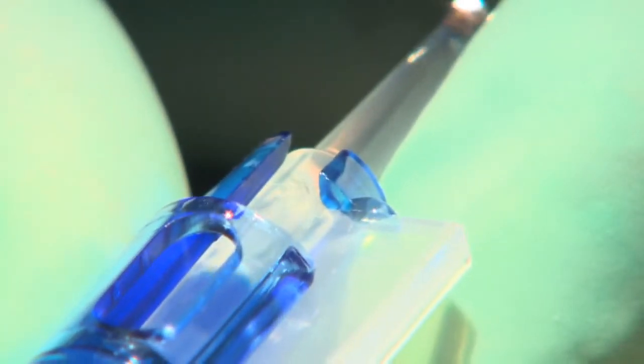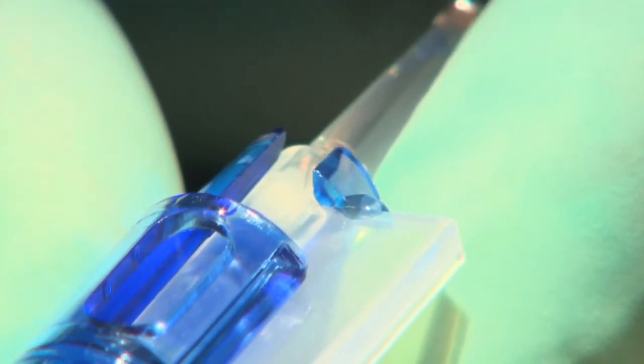The biflex lens is inserted using an injector which enables the implant to be guided directly into the capsular bag. The injector can be withdrawn from the capsular bag in a highly controlled manner without causing any damage to the surrounding structures. This injection system obviates the use of excessive force and speed, which could lead to problems during surgery during withdrawal.